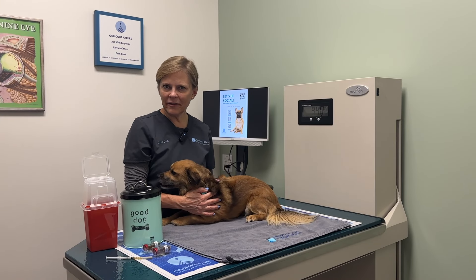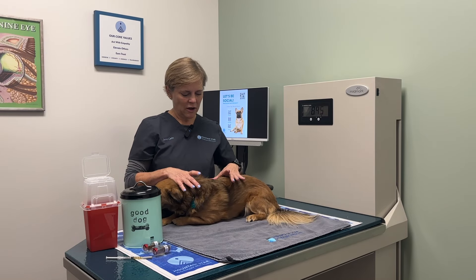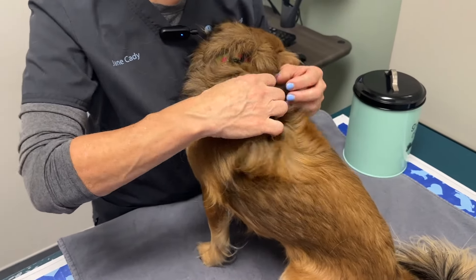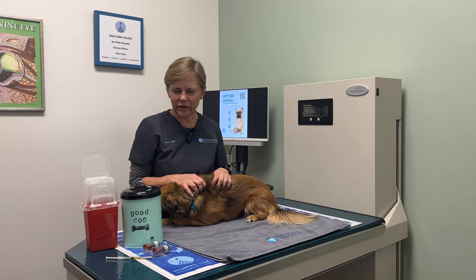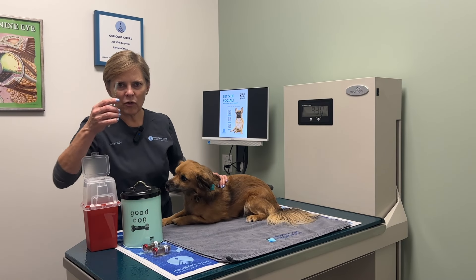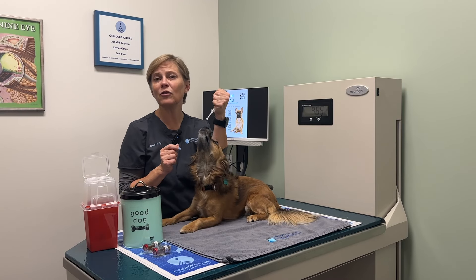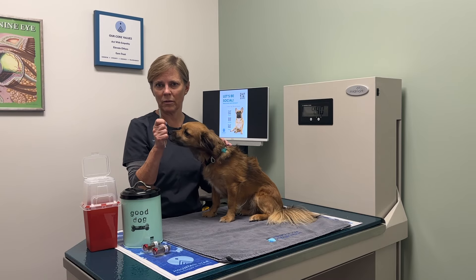The next thing to know is the area you want to be focusing on to give the injection — typically somewhere between the neck and the middle of the back. There's a lot of extra skin there and not a whole lot of nerves, so it's the least painful place to give the injection. If it was a refrigerated medication, make sure you've held it in your hand for a few minutes to warm it, because it will be even less painful if it's warm when you give it.